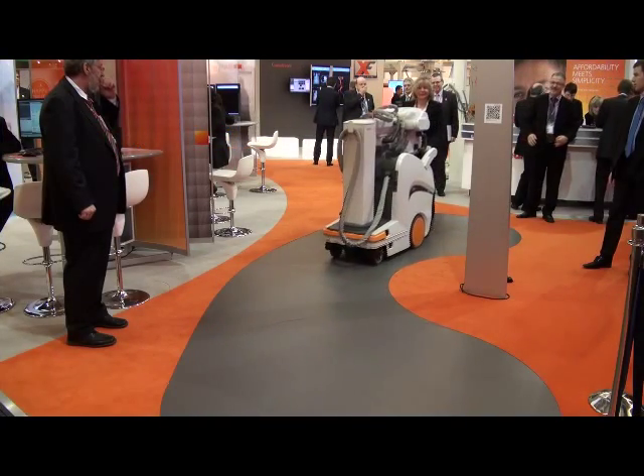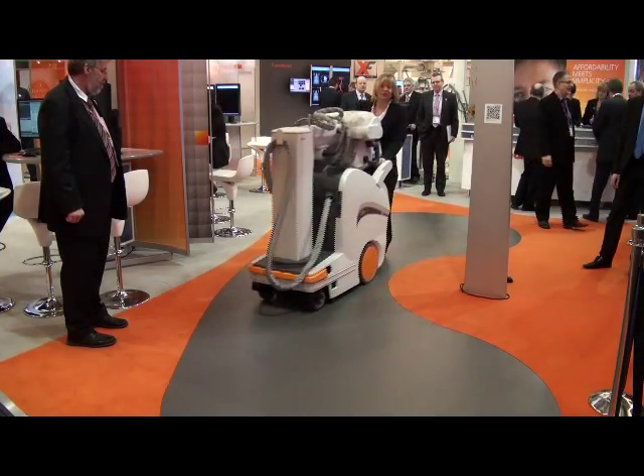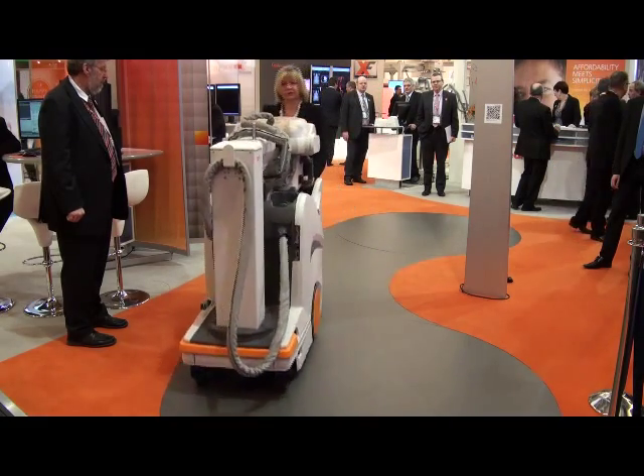In April this year we're going to be running a road show with our brand new DRX Revolution mobile x-ray machine. We're going to be taking the Revolution out into hospitals so that radiographers can actually get their hands on the equipment and drive it and use it for themselves, so they can see how easy it is to move.